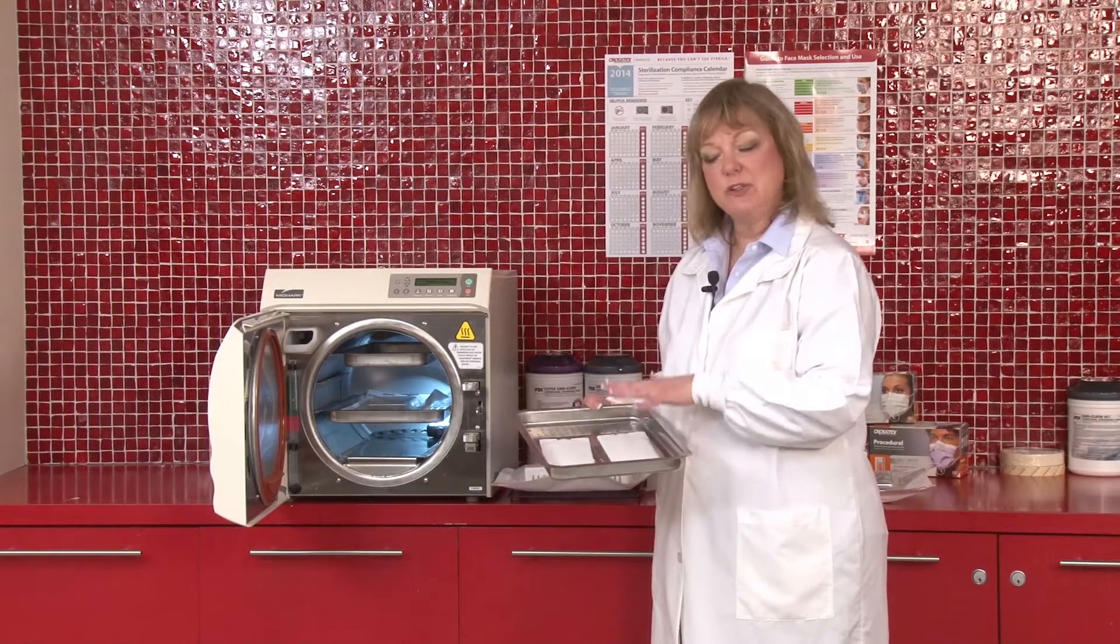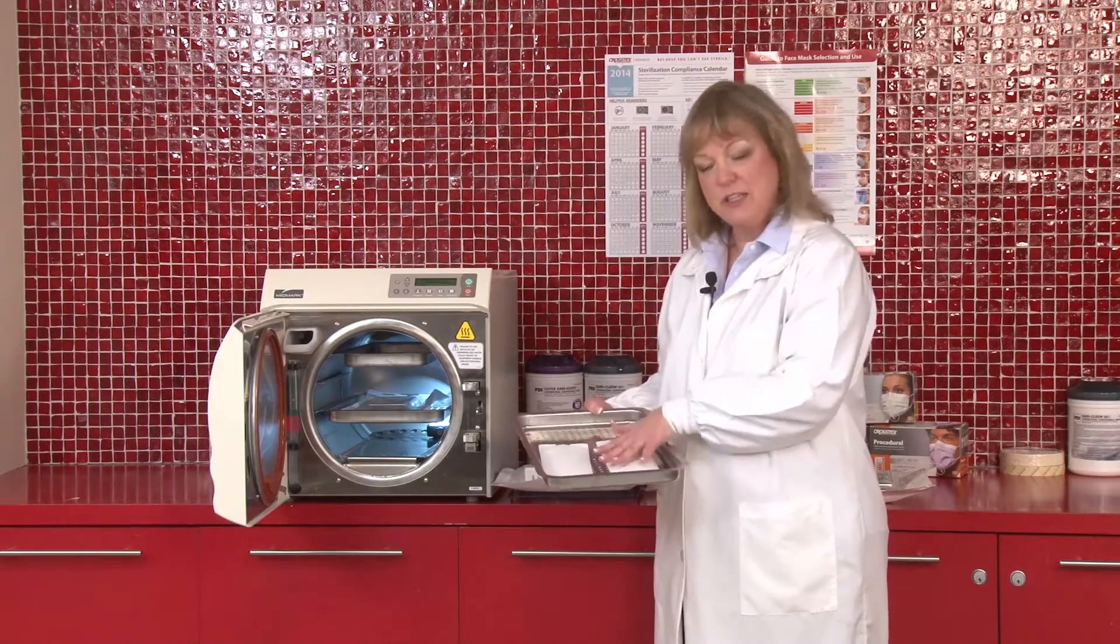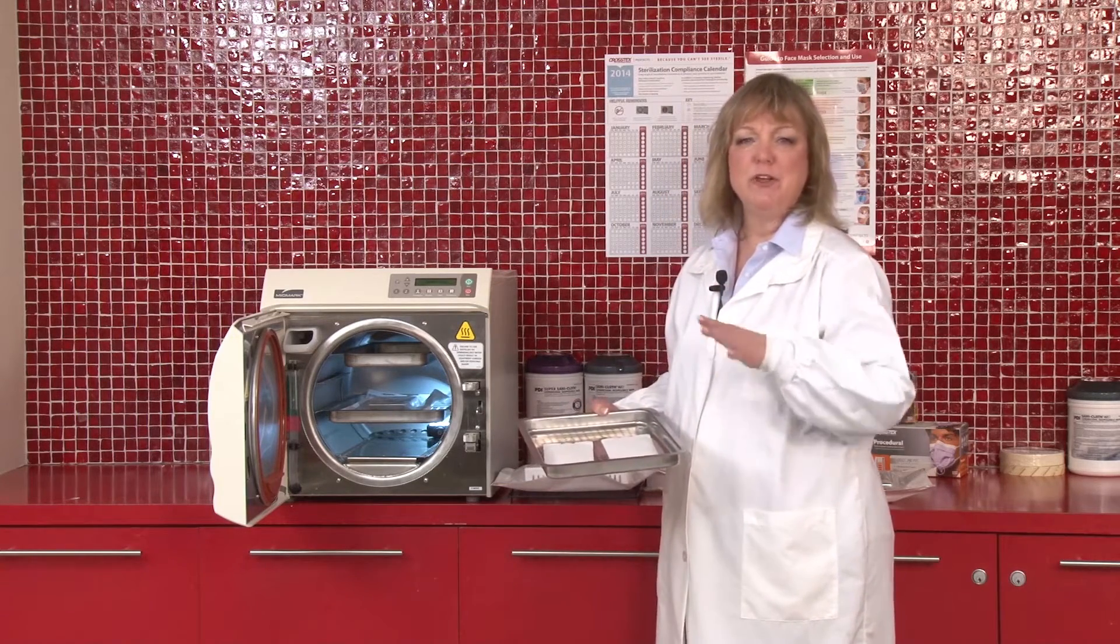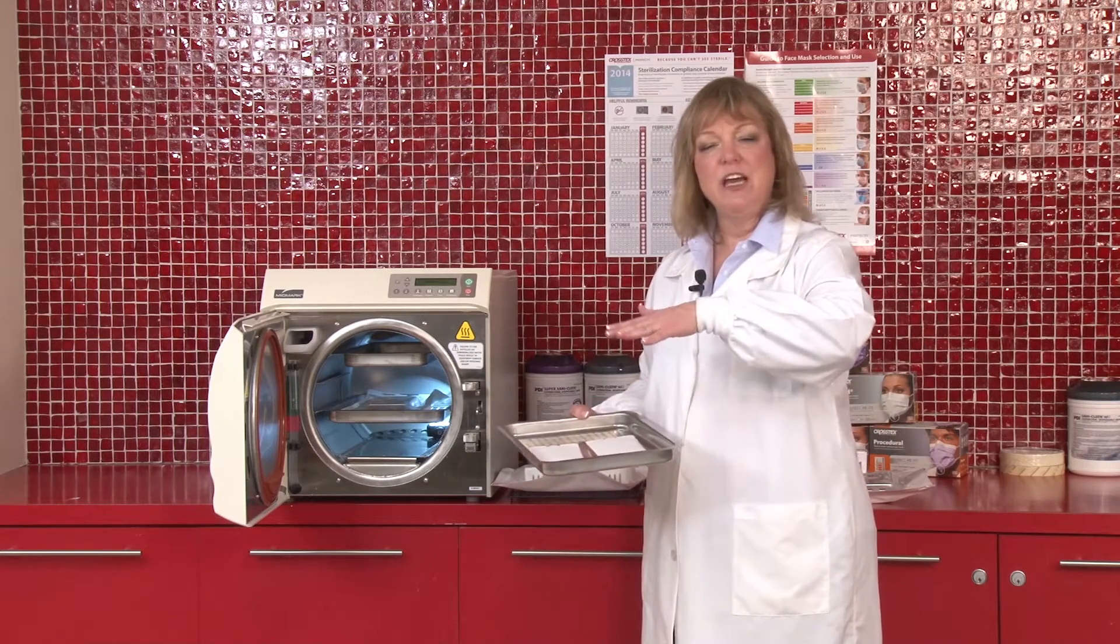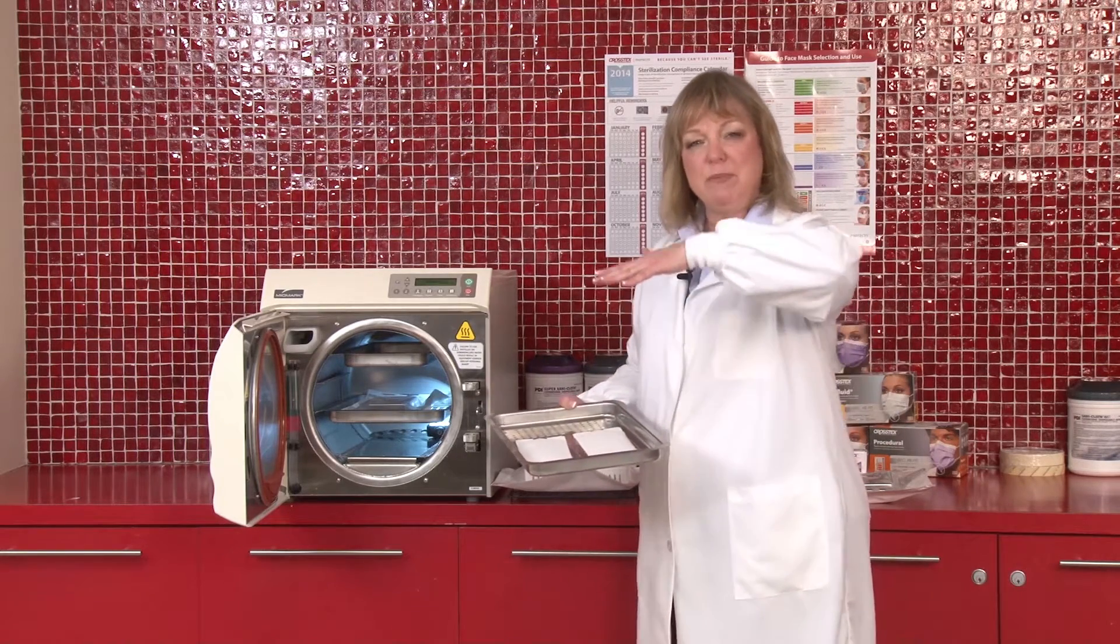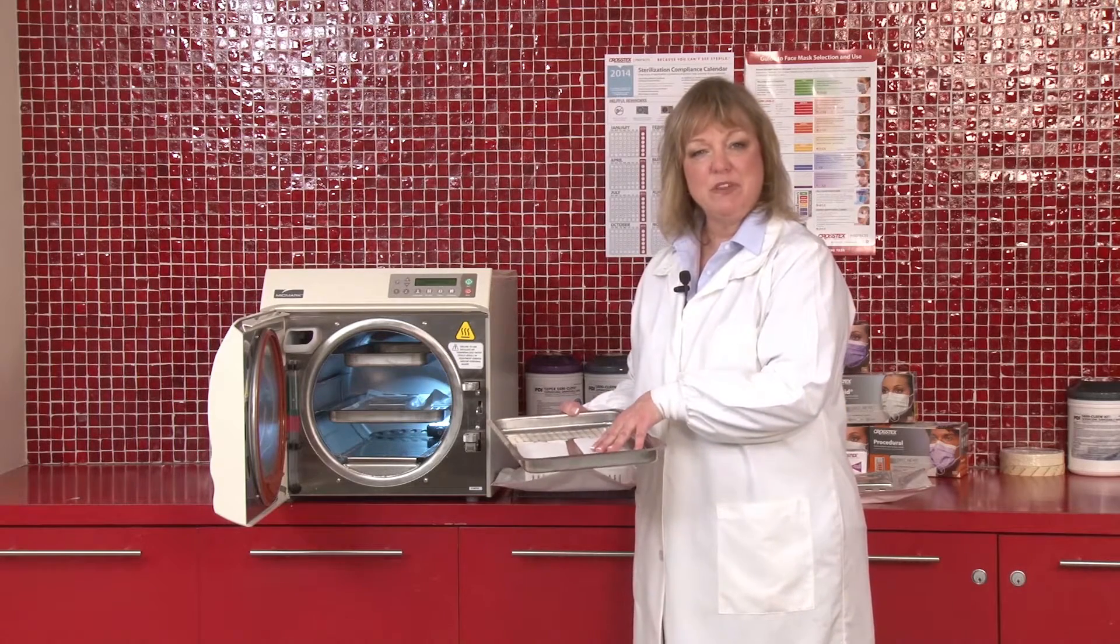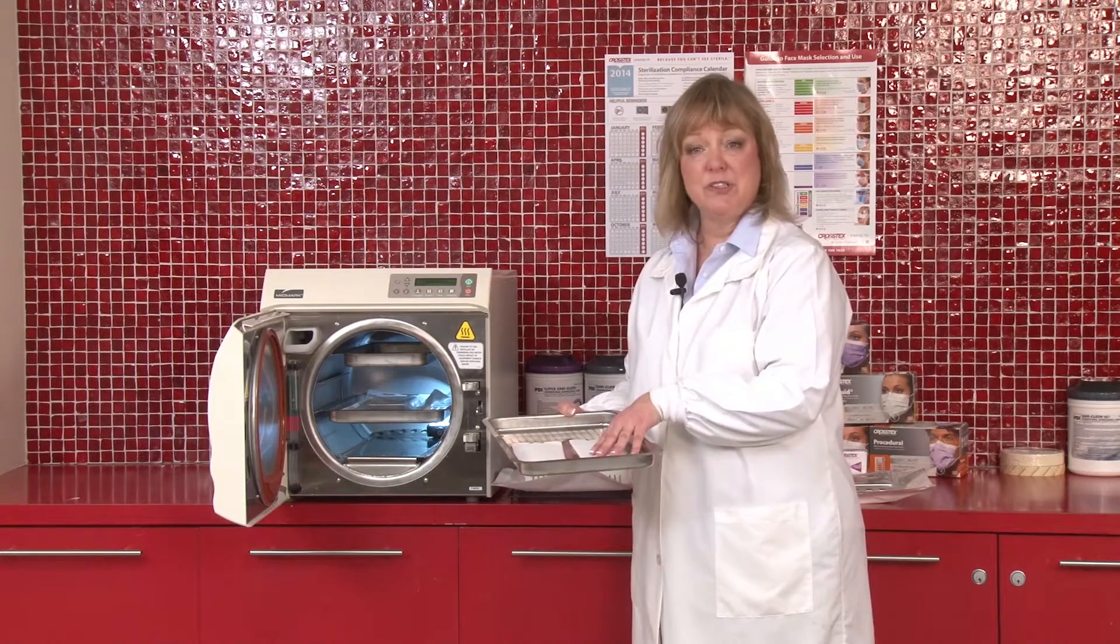The reason is because when the steam enters the pouches, these pouches expand. And I want you to think about when you're using your microwave and you have a piece of plastic wrap over the top of a dish. And if you watch, you see that that plastic wrap expands and contracts. The same thing happens with these pouches because they do fill with steam.